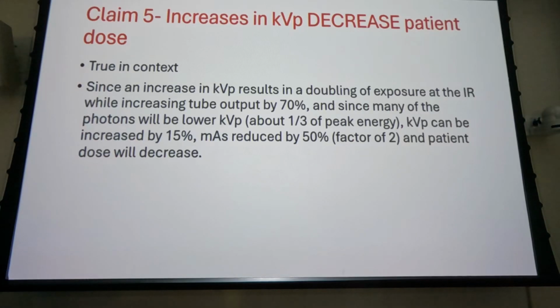So let's say we go back to that same patient we were talking about before. Your index number showed that you made a perfect exposure, but you clipped the apices. You still have to repeat it, right? You still don't want to increase the patient's dose. You still want to maintain the same image receptor exposure.